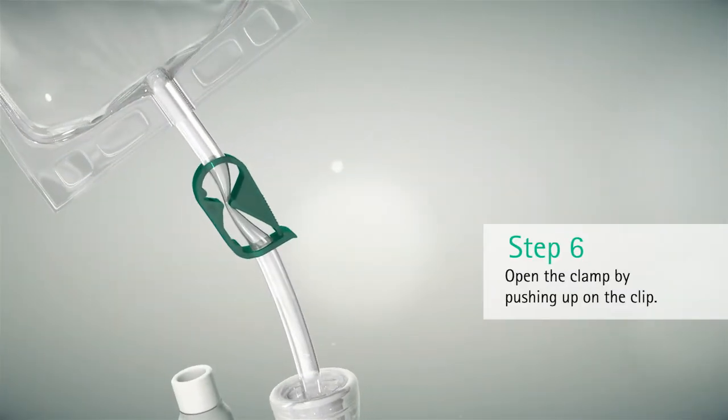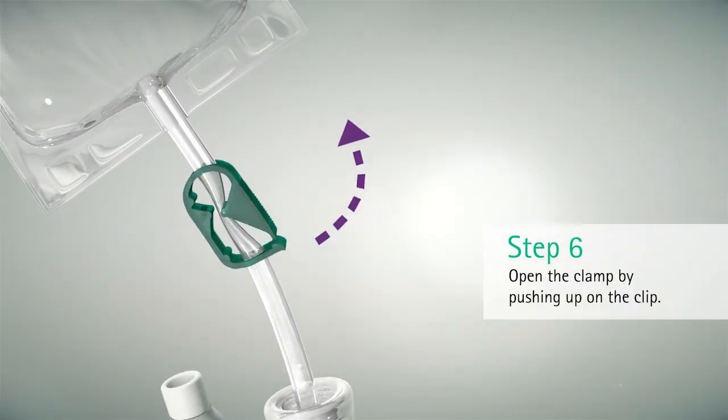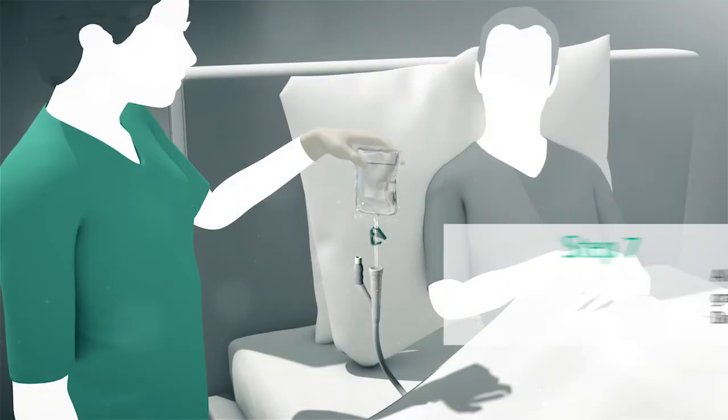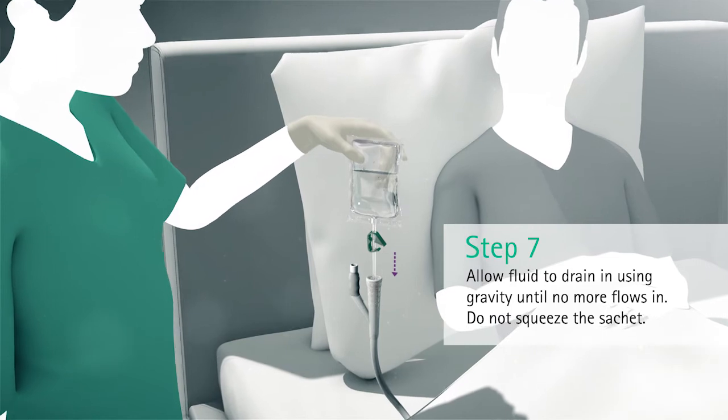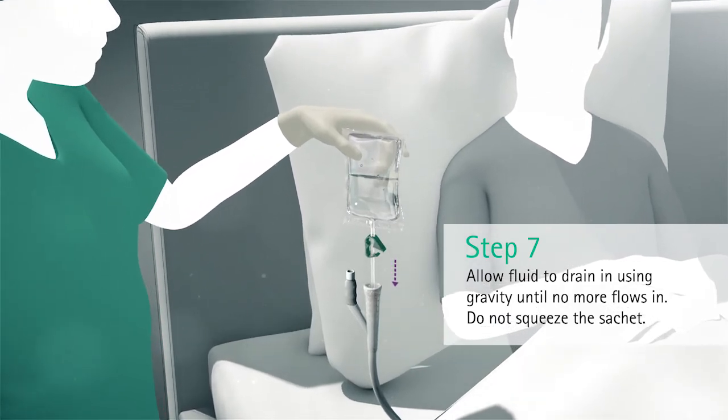Open the clamp by pushing up on the clip. Allow fluid to drain in using gravity until no more fluid flows in. Do not squeeze the sachet.